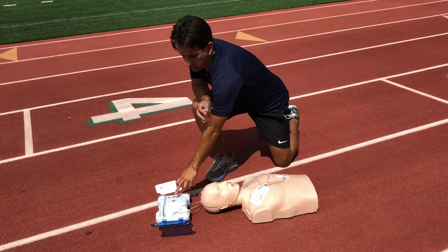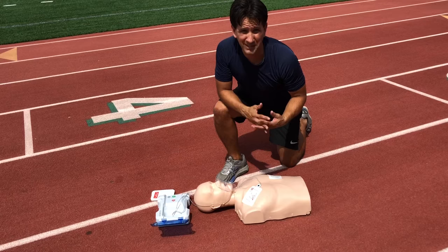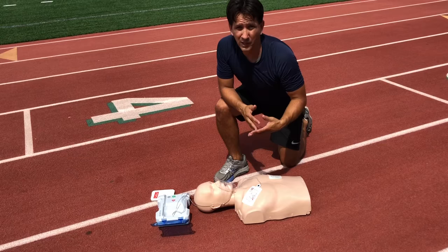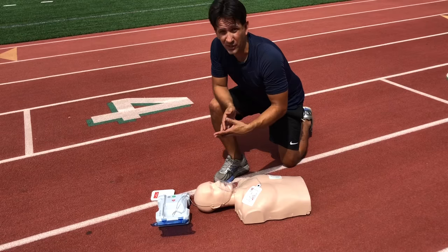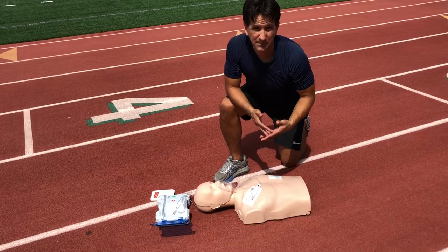The clearing portion of this skill is very important. When you say 'clear' before pushing the shock button, everybody needs to be clear of the victim — they cannot be touching them at all. An electrical charge occurs from the unit into the person, and if you are touching that person, that electrical charge will transmit to you as well and you could become injured.